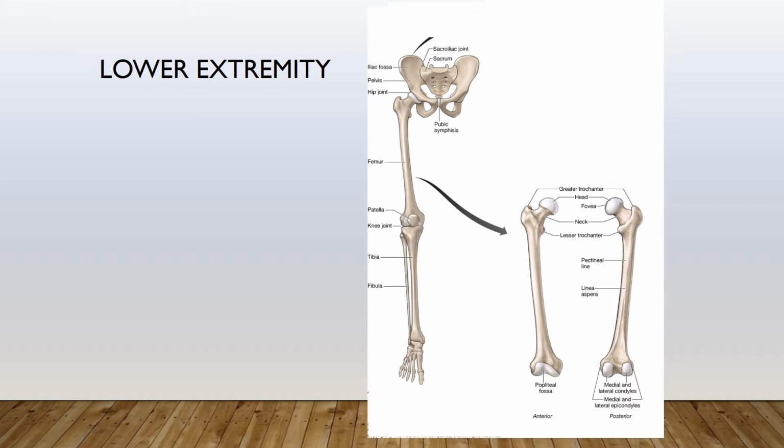When you're dealing with procedural codes, which are CPT codes, they're going to be side specific. So if I have an order for a right femur, I want to make sure that I have a CPT code for a right femur. You need to be very careful that the CPT code and the diagnostic code, which is an ICD-10 code, are appropriate. When I am x-raying a lower extremity, I'm either going to be x-raying the femur, the knee, the tib fib, the ankle, or the foot. So let's go ahead and take a look at lower extremity.